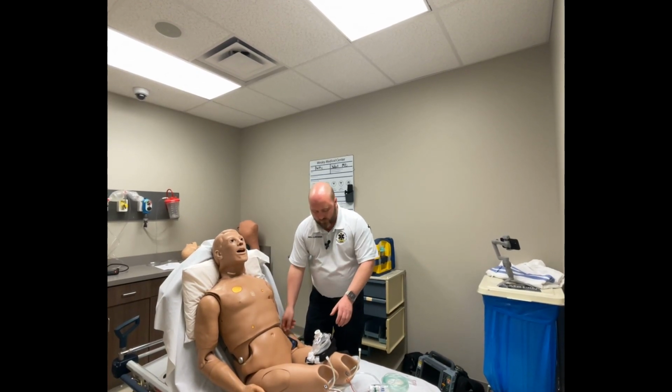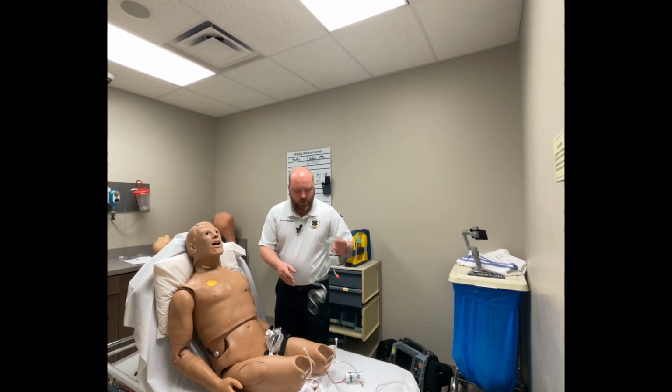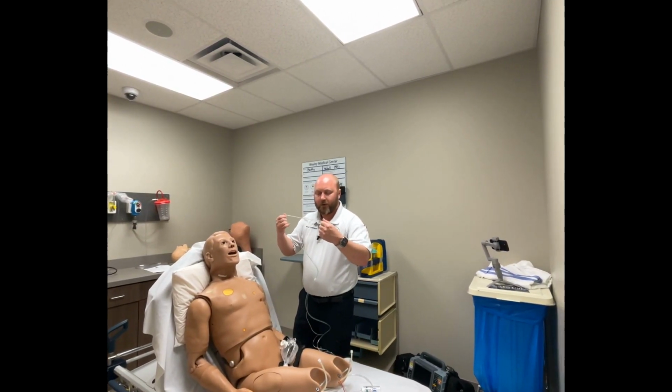Okay, so as far as CPAP, we're going to start with having the patient sitting upright. They're going to be breathing on their own. The first thing that we need to put on is the capnography cannula. So that needs to go on first, so we don't want to take off that CPAP later to put this on.